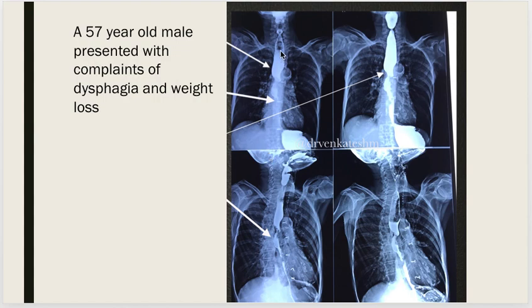You can see the contrast opacifying the entire length of the esophagus and entering into the stomach. The first abnormality is a holdup of contrast in the upper one third of the esophagus, with a mild air-fluid level and narrowing at the cervical level.